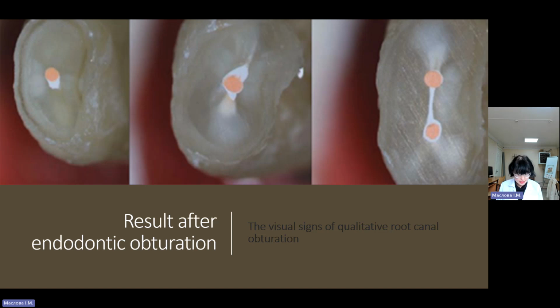The heat can be carried to the gutta-percha in the canal by a variety of ways, including flame or electrically heated carriers, like this heat source. This device has the advantages of accurate temperature control as well as different diameter plugger tips to accommodate a variety of canal widths.